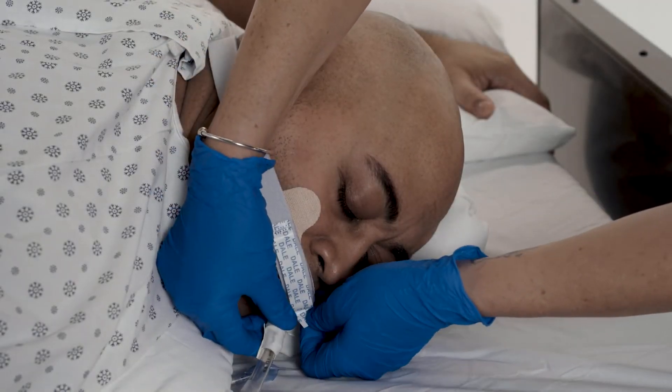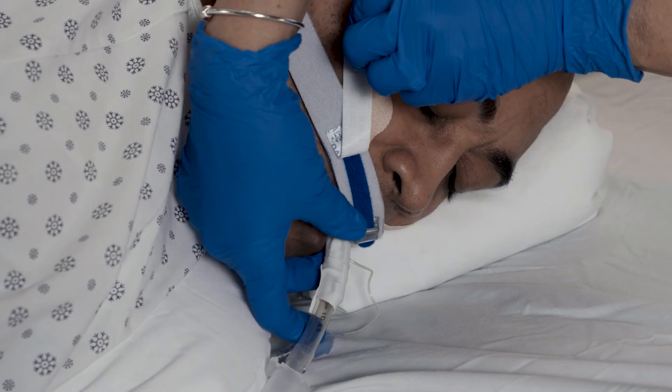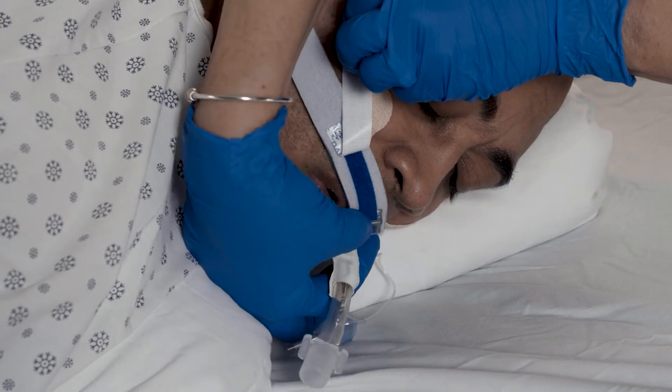The Dale BreezeLock Endotracheal Tube Holder can also be used on patients in the prone position.